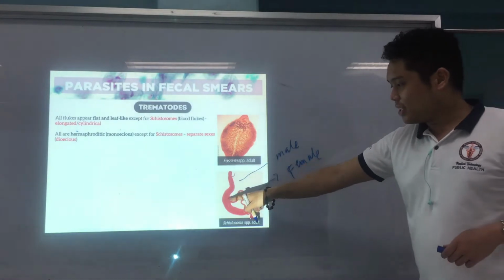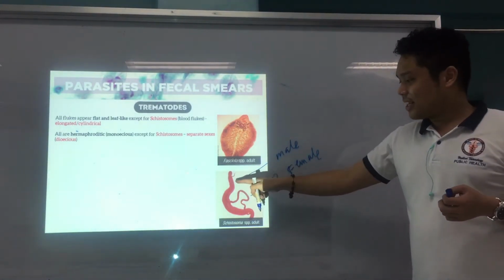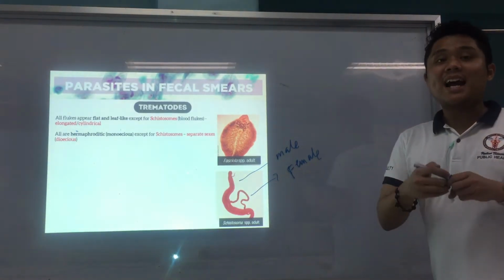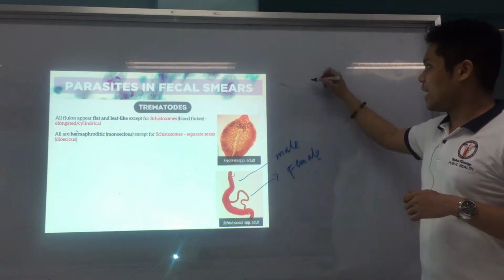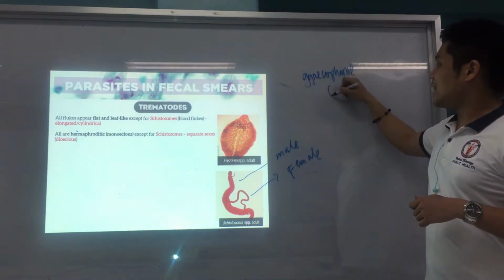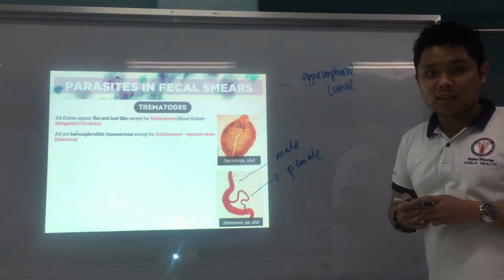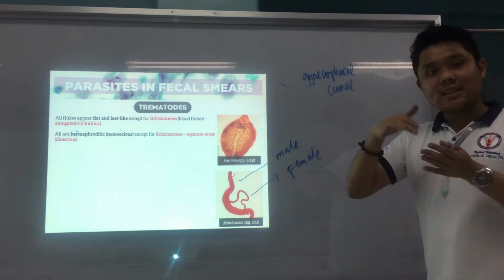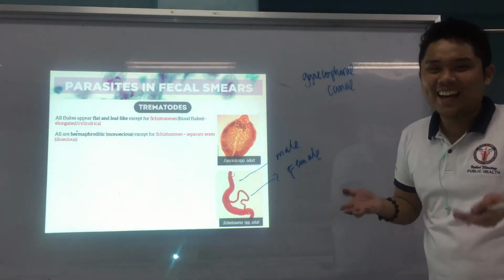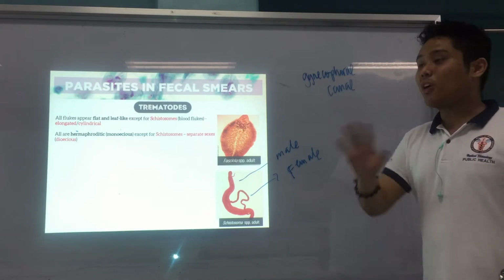Now, your male, as you can see, the center of that, di ko kabalo mo draw, guys, but the center, kabantay mo kung asa nagsulod ang female, it's a canal. And that's what we call a gynecophoral canal. That is found in the male Schistosoma adult. The female goes inside, and magsige na sila og sex. Magsige na sila produce og eggs forever.